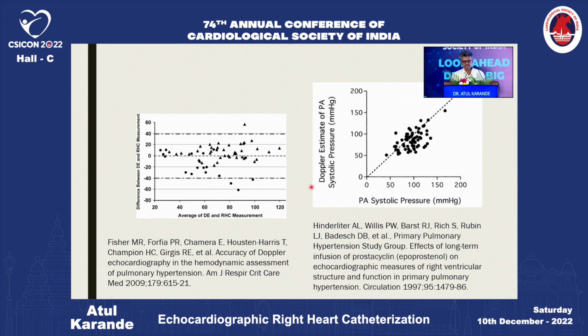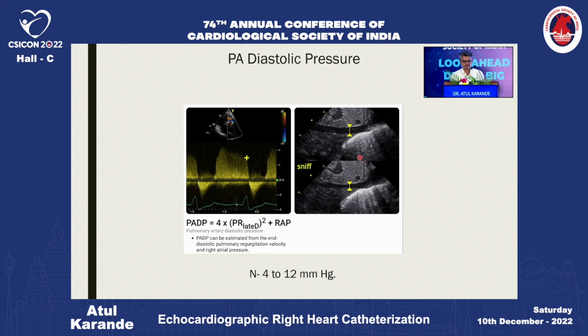But some studies have questioned the accuracy of this relationship, particularly at higher PA pressure levels. Here we can see that there is a scattering at higher levels of PA pressure. Then the next parameter to be measured is PA diastolic pressure.